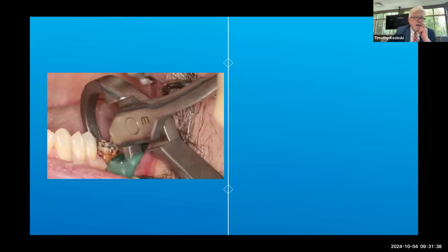And I'm not going to take a lot of time with this, but many of you are aware that I love the physics forceps, if you can Google it, from Gold-Dent. It's a series of 3 instruments: upper right, upper anterior, upper left, and lower universal. It has 2 components. The beak is a shovel-shaped edge, which will engage the lingual surface of the root, 1 to 3 millimeters subgingival. The bumper will be placed down the vestibule as far as possible. It's simply a center of rotation.